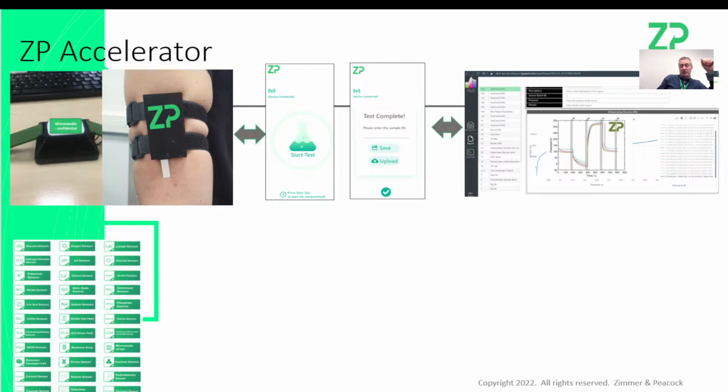So if somebody said to me, I want to do a prototype, I say prototype, but not minimally viable product, because minimally viable product would suggest that you could then just give it to a clinician, and off they go. You could give it to a clinician, but it's the reliability I'd be concerned about. But taking one of our sensors, putting the correct electronics on it, and making a connection between the electronics and the smart device via Bluetooth is really no issue.